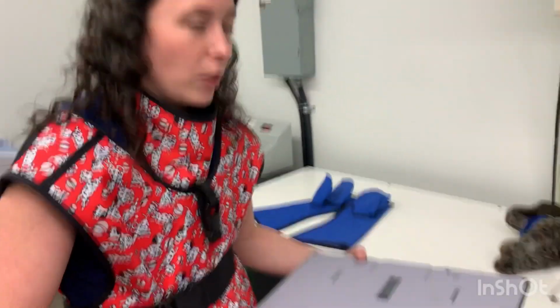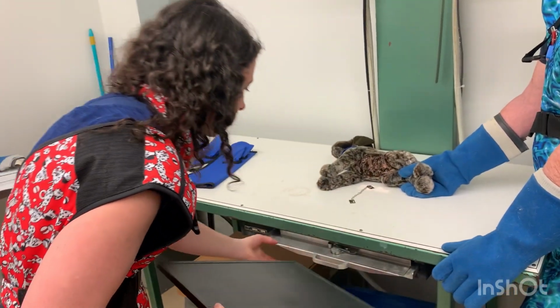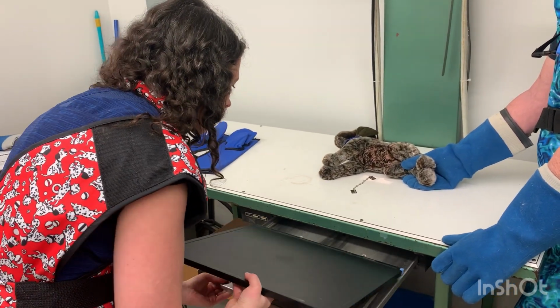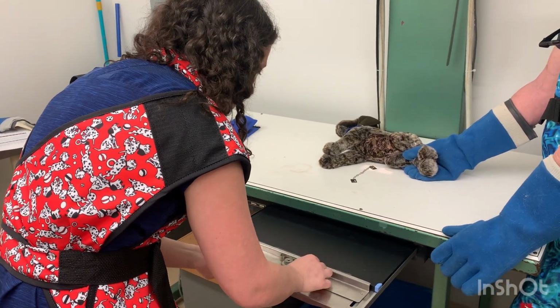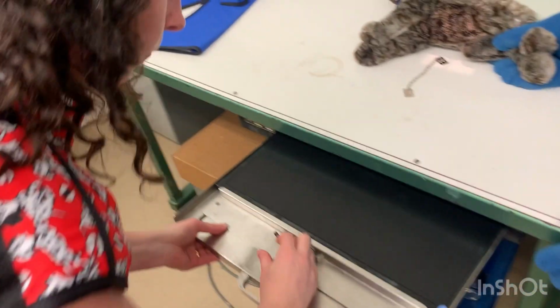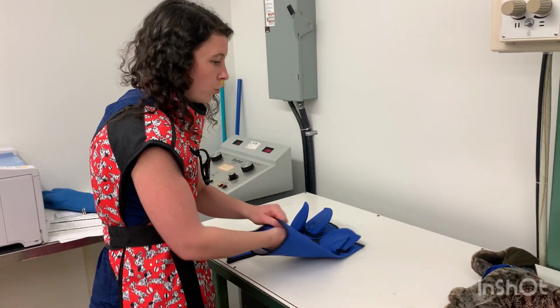So then what we would want to do from there is this processor actually erases the image, because it's taking the latent image out of it and erasing it so we don't get the static. So now I don't need to erase it again, but I do need to flip it over black side up. It goes back in here like this. We're going to need to lock it now. And we're taking our next image right away.